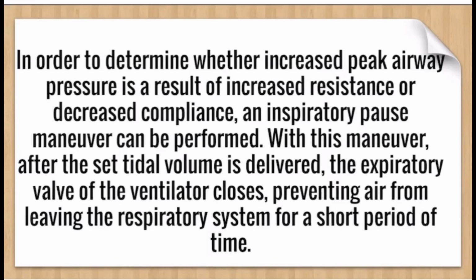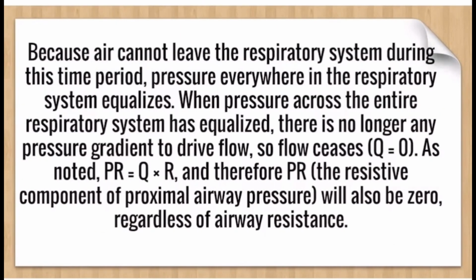So no air can go out. Because air cannot leave, pressure everywhere in the respiratory system equalizes.